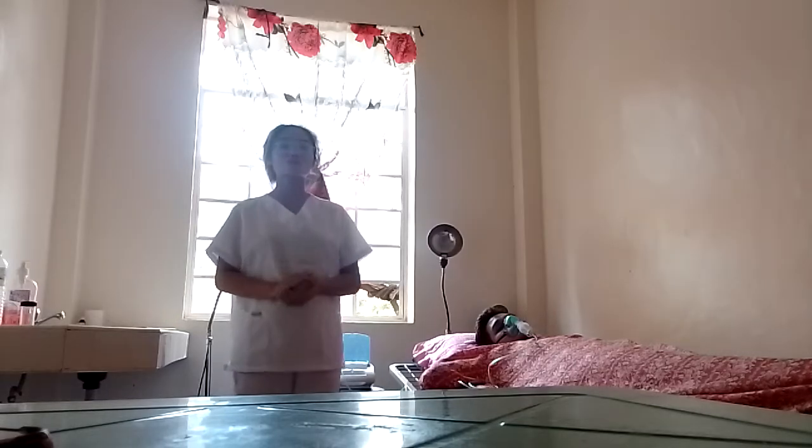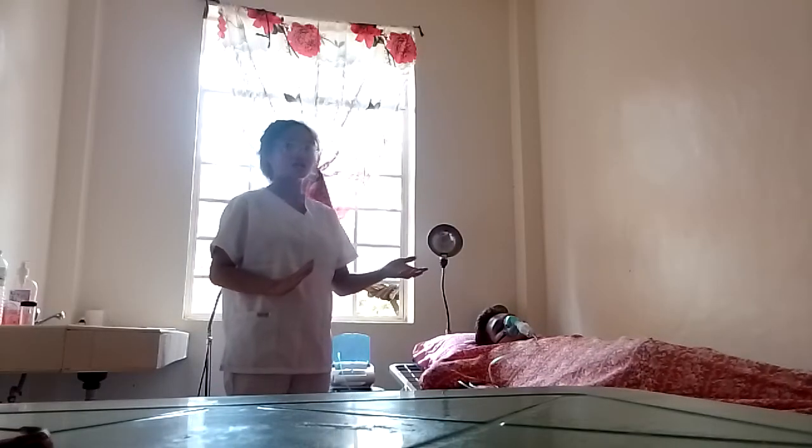Okay. Okay, so the next thing that we need to do is we need to check for proper flow rate every 4 hours. Okay, so ato dyan na siyang i-check every 4 hours. And there are tendency that a flow meter might change. Kaya naabiray tendency nga ang ato ang flow meter ma-change. So dapat ato siyang i-check every 4 hours. Okay? Okay na ka diya, sir?